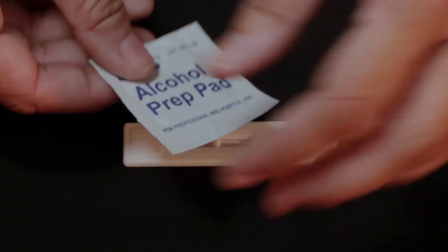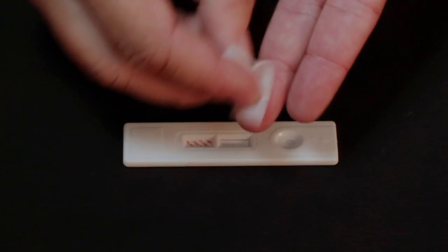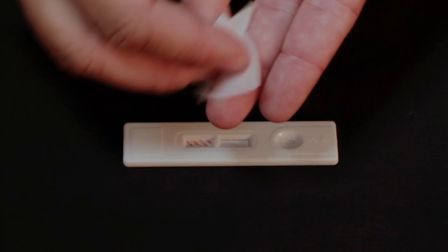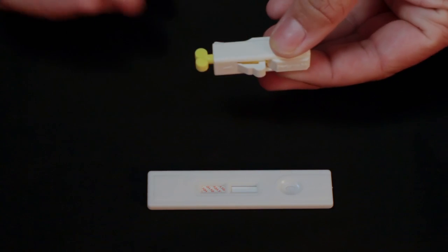Open the alcohol packet and sterilize the finger to be tested. You'll get the best results drawing the sample from the inside of the finger. Clean the entire tip of the finger by rubbing with the pad for 15 seconds. Next, prepare the lancet by turning the yellow key twice and pulling to remove.